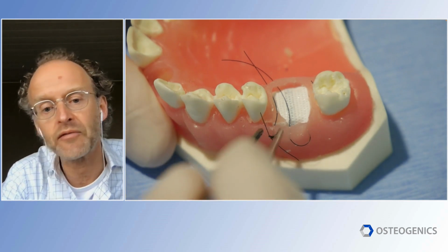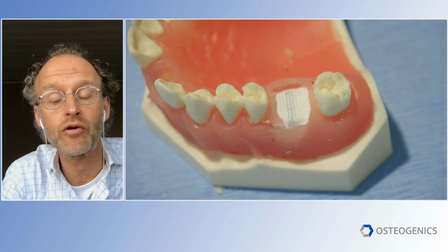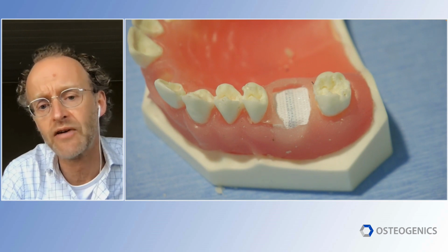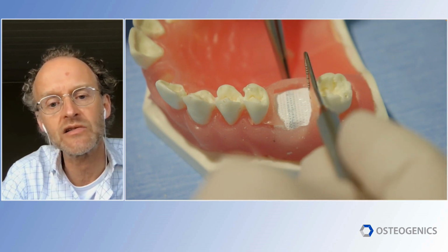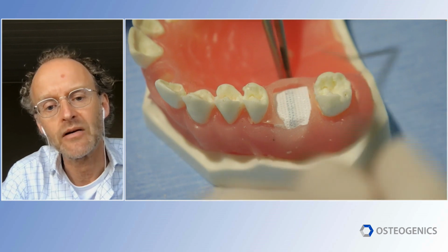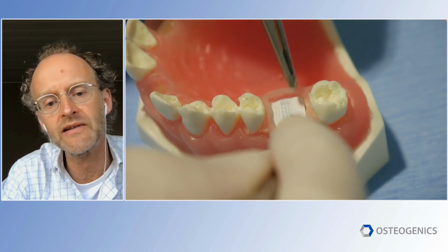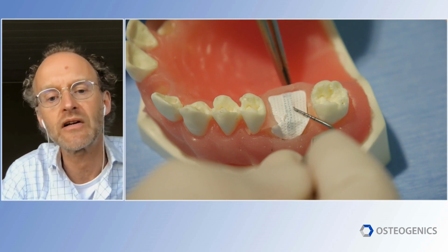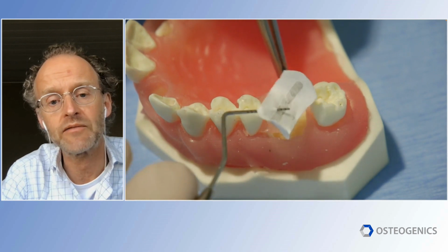Sutures can be removed after 2 weeks or 4 weeks. The membrane is removed 4 weeks after extraction, and with the larger, severely resorbed cases, I would advise 6 weeks. And with this titanium reinforced version, if you use this, you can lift it up a little. You have to get grip of it, and then you can stick the periodontal probe through the membrane underneath the titanium bar or strip. And then it's very easy to pull it out, and mostly you don't need anesthesia for the patient. And you lift it out.